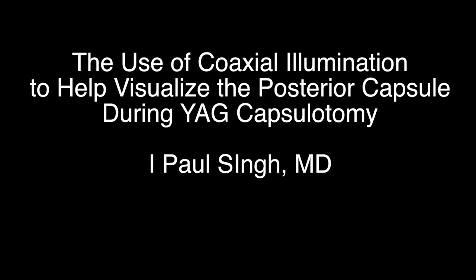This is Dr. Innerpal Singh describing the use of coaxial illumination to help visualize the posterior capsule during YAG capsulotomy.